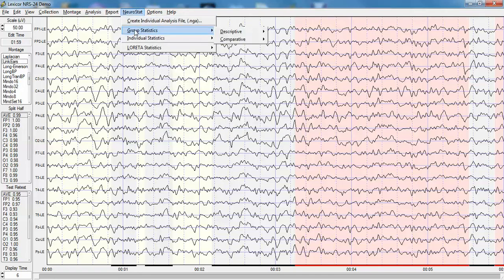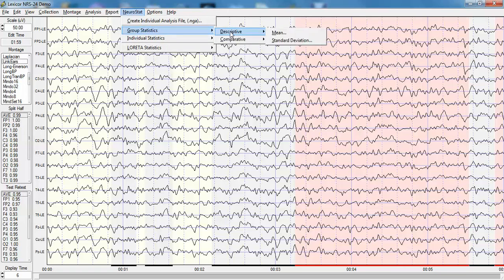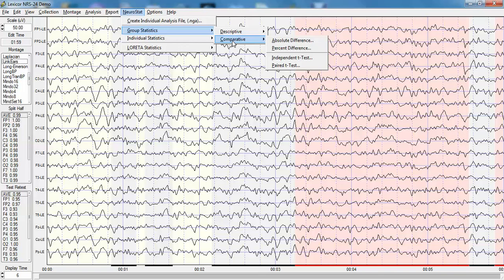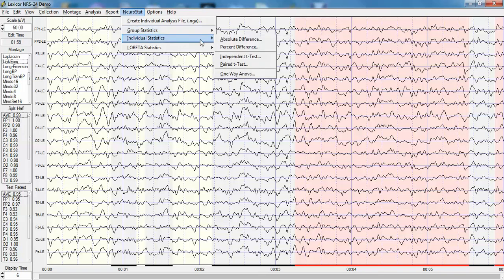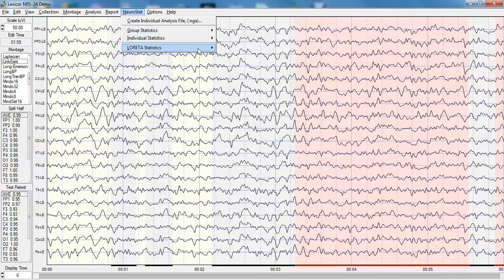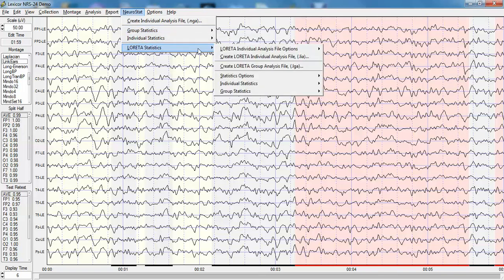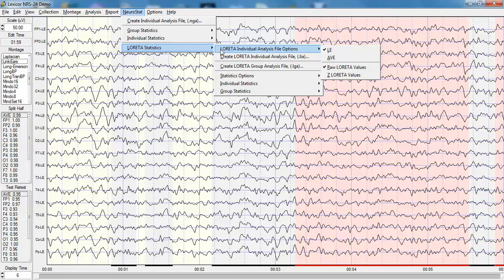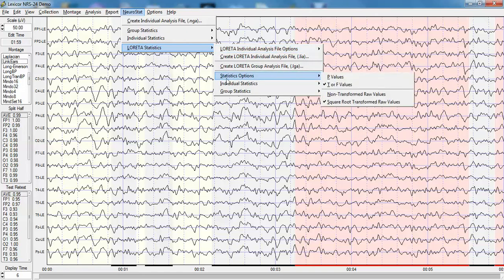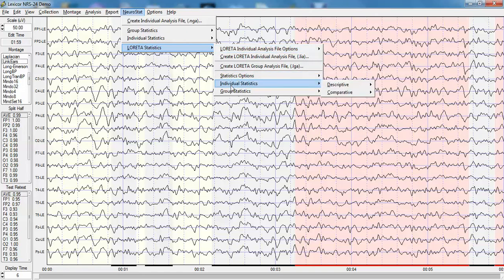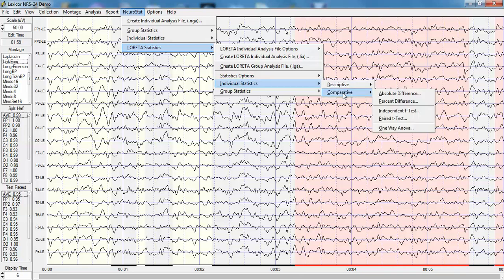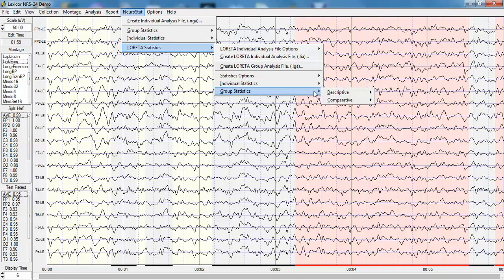NeuroGuide also has NeuroStat that allows one to do descriptive statistics of surface EEG and comparative statistics, independent t-tests and paired t-tests, individual statistics as well as groups. One also can do statistics on Loretta for both Z scores and absolute values, for p-values, t-values, individual statistics, and comparative statistics, the same as the surface, but now it's in three dimensions.